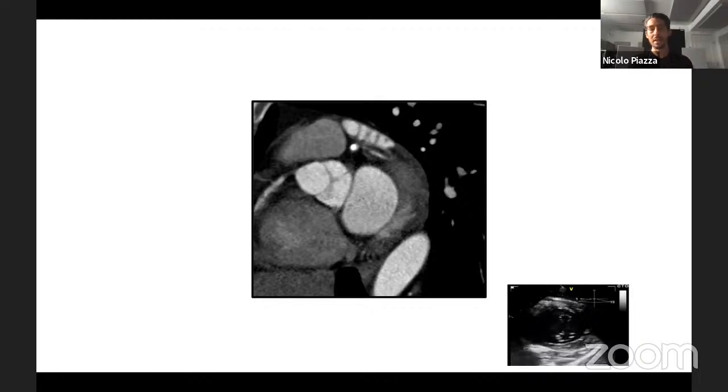Because I can tell you that there was a moment where I was trying to wrap my head around what posterior really means, what anterior really means, and what superior and inferior puncture really mean. And then I told myself, well, okay, this is all relative to a target structure. What is your target structure? Where are you going? And how do those target structures look in the views that we're using to puncture?